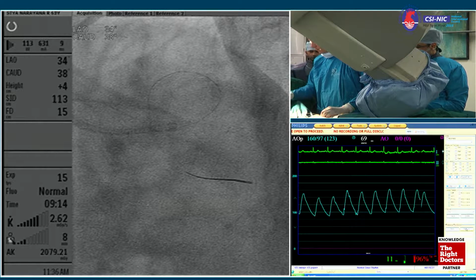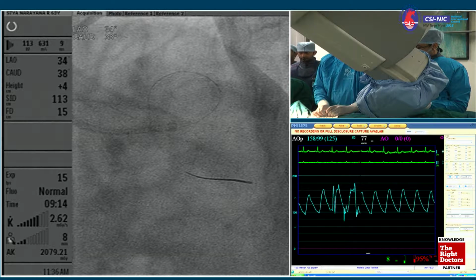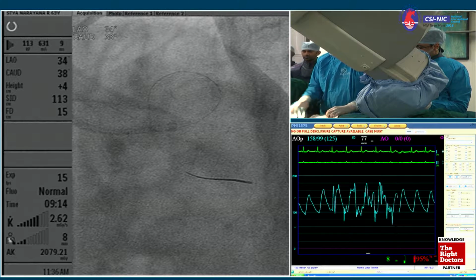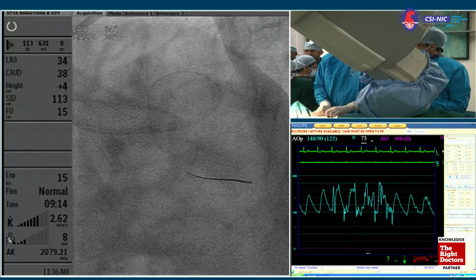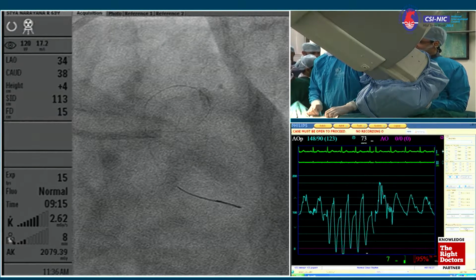I would love to know from Dr. Naber and from the senior members present here whether they now consider imaging an optional event for left main or a must. Dr. Madekar, then Dr. Vijay, any comment?